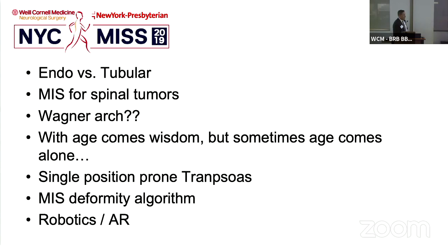I think in this case, the 3D model that you see does help, in my mind, as an open freehand surgeon. It helps me to confirm the entry site on the 3D model. But outside of that, that part of it is really the augmented reality part. I agree with you. I don't think it adds a whole lot. But for me, having the heads-up mounted display is really the novelty of it, and I think that's where the benefit is, preventing the attention shift.